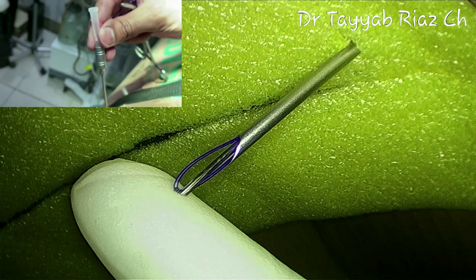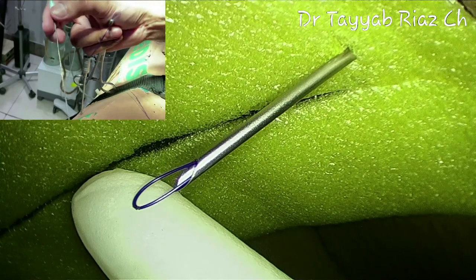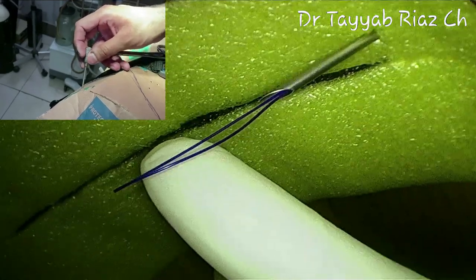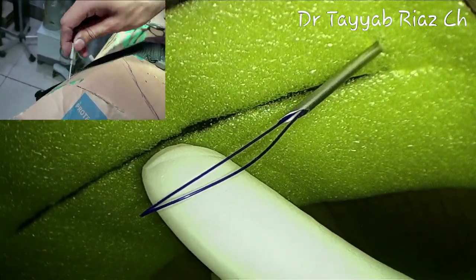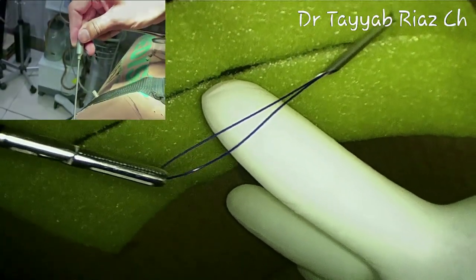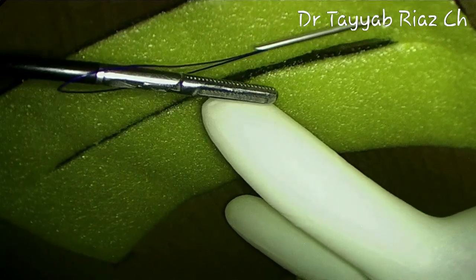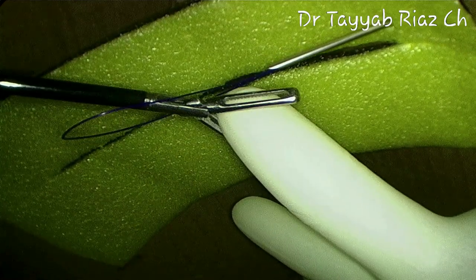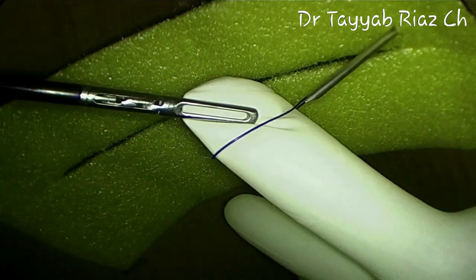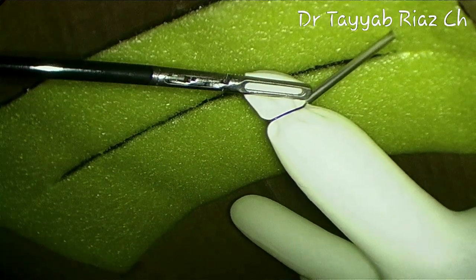Then remove the loop passer out, or you can grasp the loop with some grasper and then remove it. After that, feed some extra length of the loop inside the peritoneal cavity, and then with the help of the grasper you can further pull that loop inside as desired. And then, going through that loop, hold the tip of the appendix with the grasper and slide that loop over the tip of the appendix with the help of the Veress needle and the grasper. Then tighten the loop by pulling it outside.